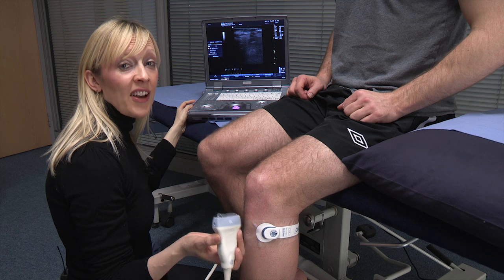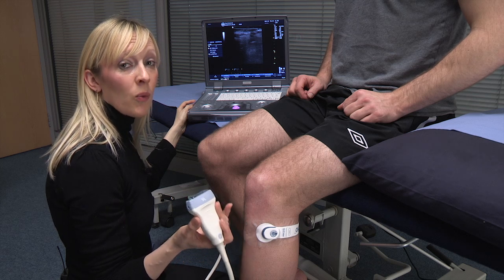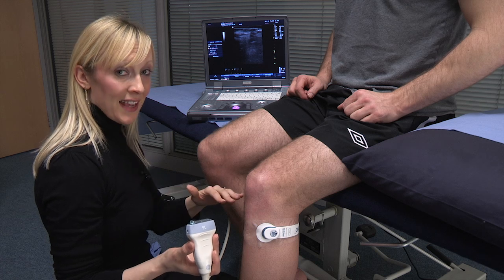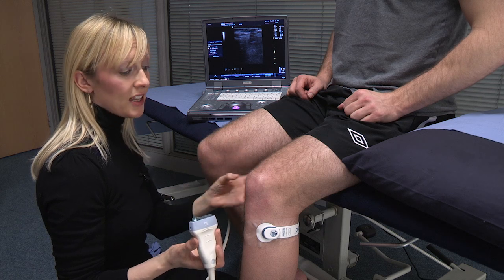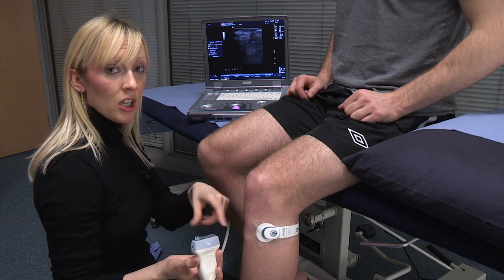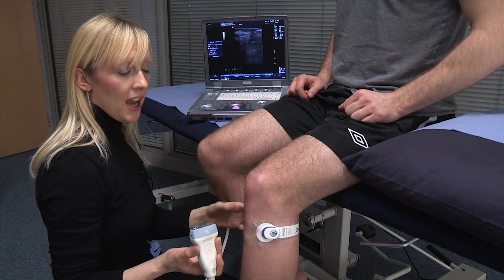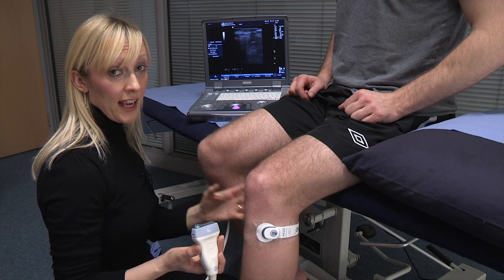I'm Dawn Smiles and I'm a vascular scientist. I'm about to scan Tom Wainwright's leg. What we're going to do is look at his leg, do a baseline scan looking at the volume of blood that comes back up to the heart at rest in the popliteal vein. Then we're going to scan again but this time with the gecko on, which will force blood back up to the heart every second and look at the difference in volume — the impact the gecko is going to have.